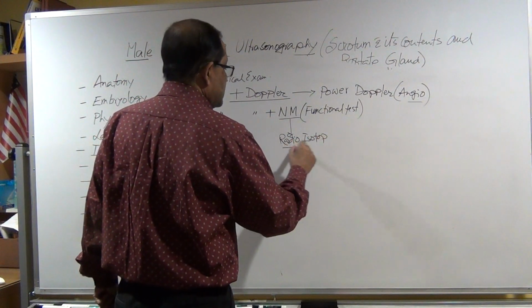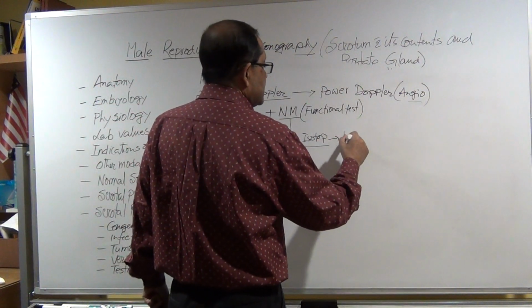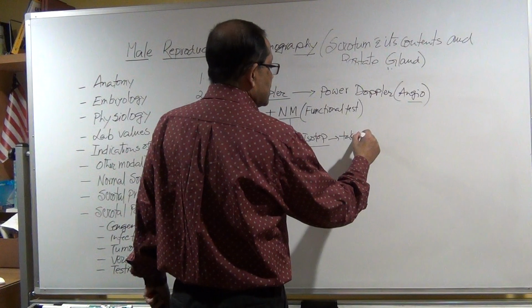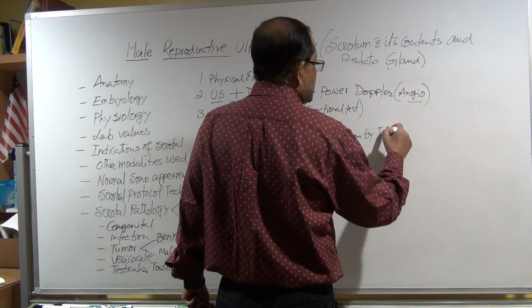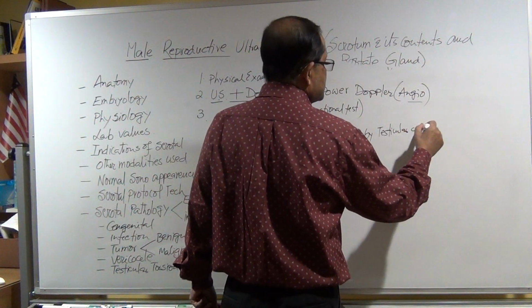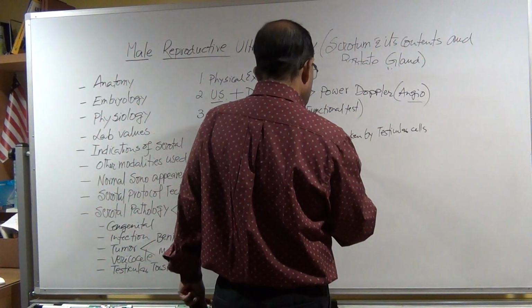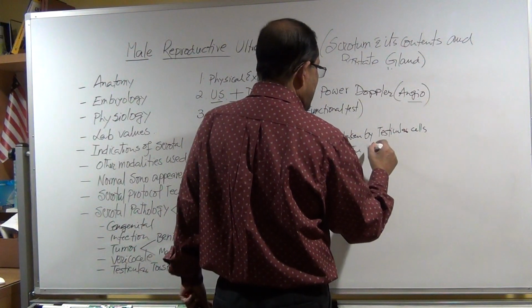This radioisotope will be taken by testicular cells when the cells are alive.